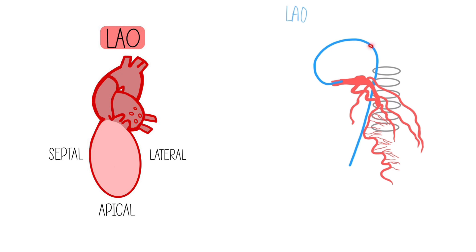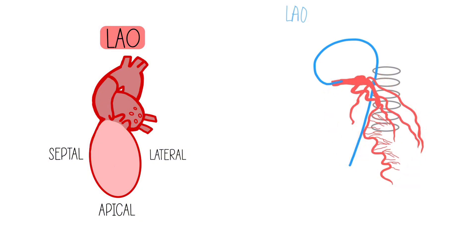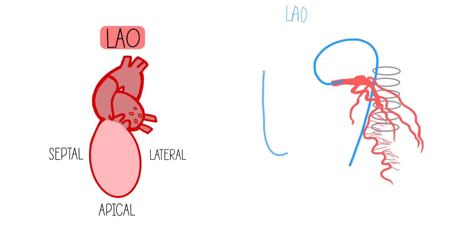LAO — not only is the catheter on the right hand side, but look at these epicardial vessels. Can you trace the heart shadow? You see that longer football shape, versus RAO which goes the other way. This is definitely an LAO view. In LAO, if we draw our little image to help us remember, the acronym is SAL — S-A-L — for septal, apical, and lateral. So what coronary artery reaches down towards the apex? The LAD. And what vessel feeds the lateral wall? The circumflex.